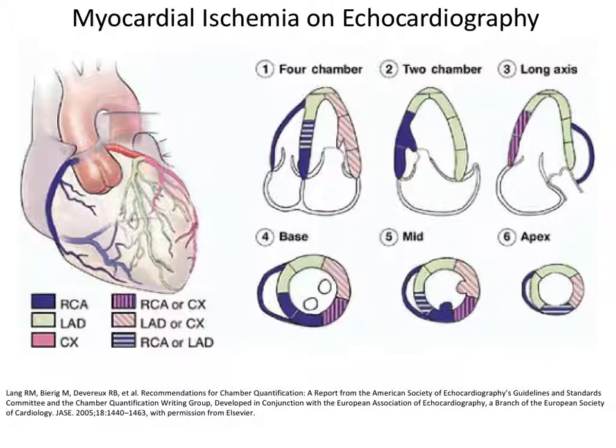It doesn't do it over the whole ventricle all the time. Sometimes it does, but if you have regional ischemia, you will see on the echo that region will not be contracting well. And so when people read echo, going back 5 slides, they click through those regions and tell you how each one is doing.